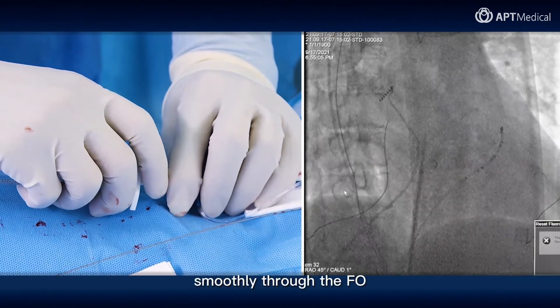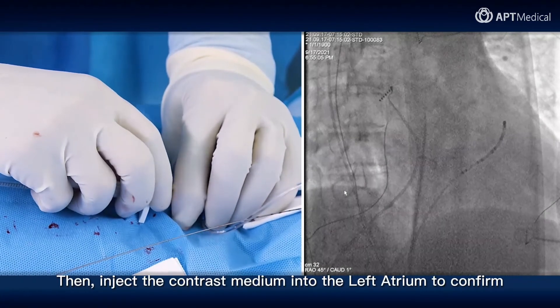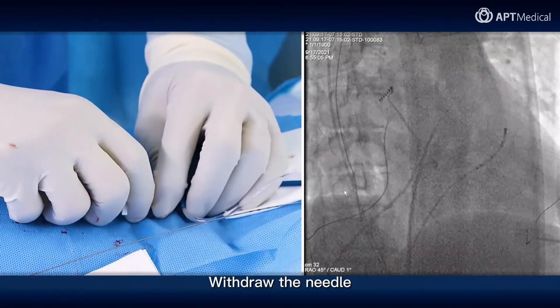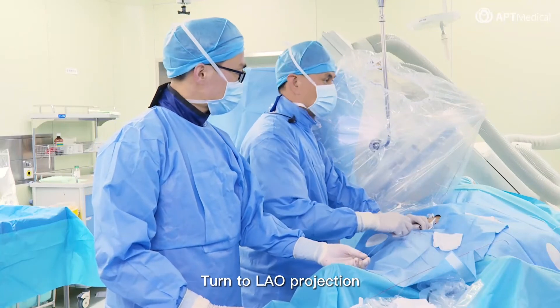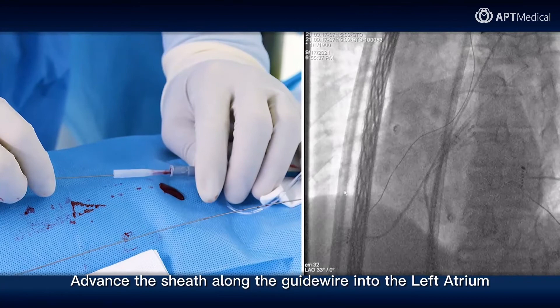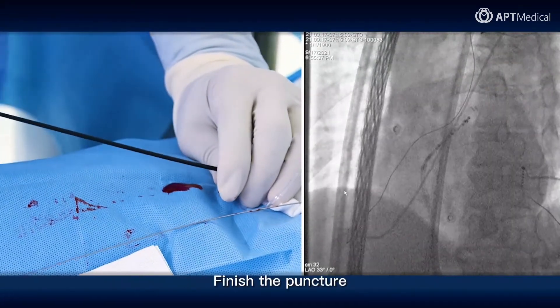Now puncture smoothly through the FO. Then inject contrast medium into the left atrium to confirm. Withdraw the needle. Turn to LAO projection. Advance the sheath along the guide wire into the left atrium, then withdraw the dilator and guide wire. Finish the puncture.